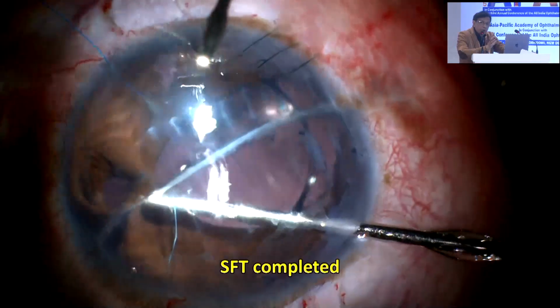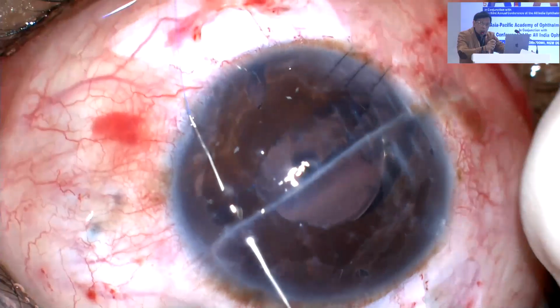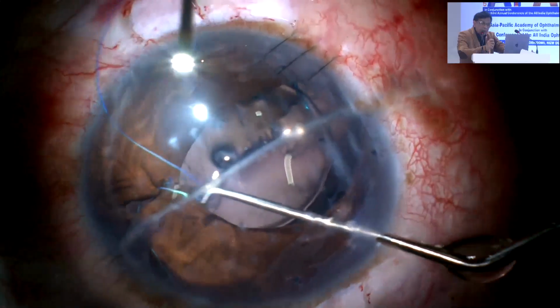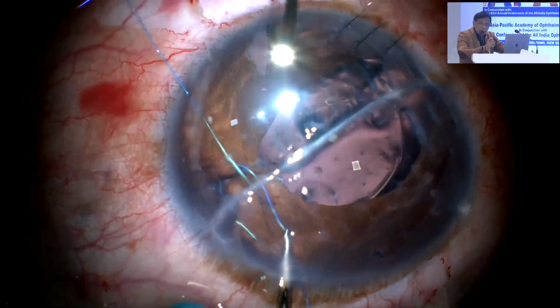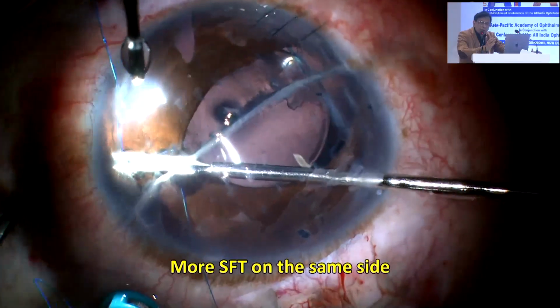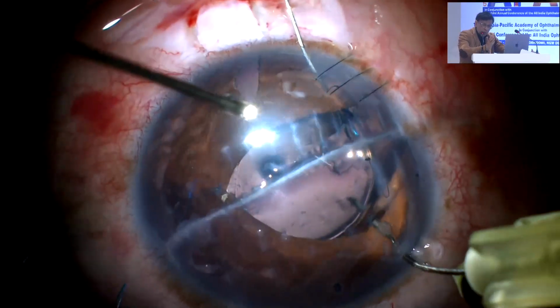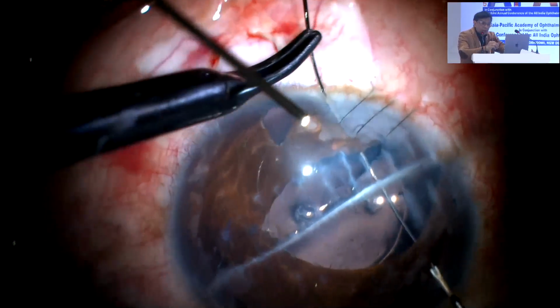A simple rule you can follow is, we have designed also a Holladay pinhole device. So keep it in front of the patient, made by Epsilon. What we do with the help of Jack Holladay, we made that. Keep it in front of the patient, ask him which pupil he likes. If he likes 1, we'll make the pupil 1. If he likes 1.5, we'll make it 1.5. But look at what I'm doing.